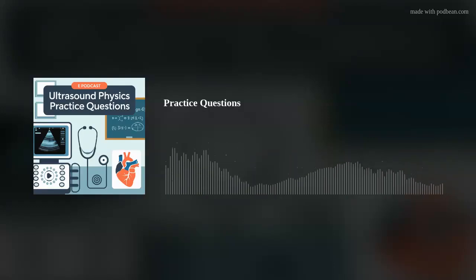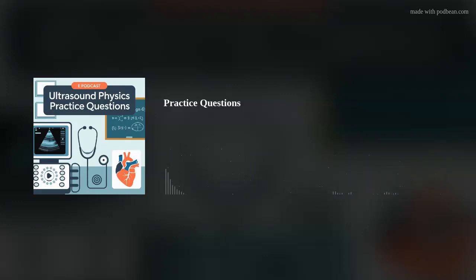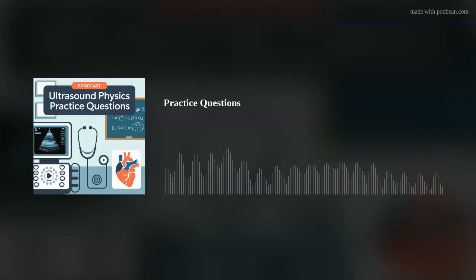So those sound waves are basically playing ping pong. Are there any ways to stop that ping pong match? Sometimes you can minimize them just by tilting the transducer a little. Oh, okay. Kind of like changing your position to break up that echo pattern. Other times you might switch to a different imaging technique that's less likely to have those artifacts. Good to know. So sometimes a simple change in how you're scanning can make a big difference.